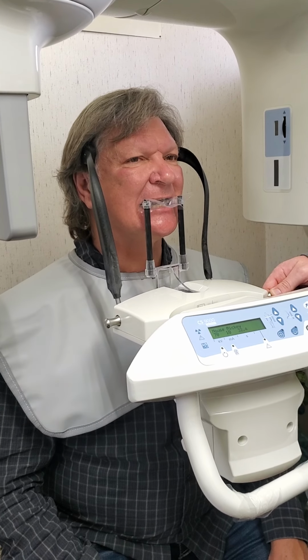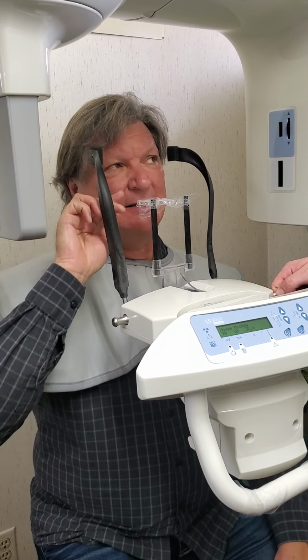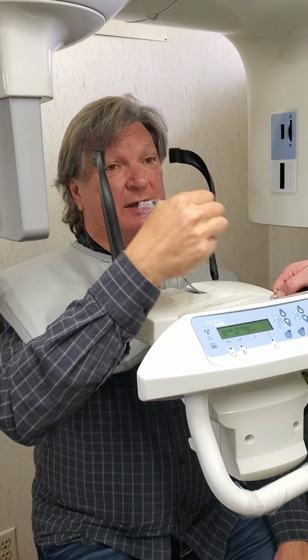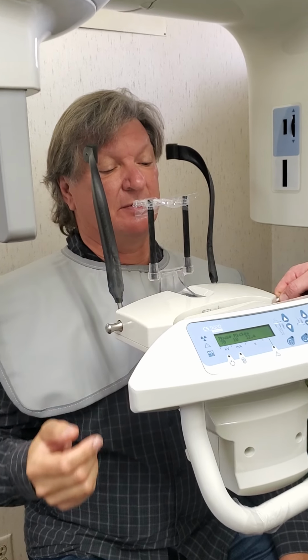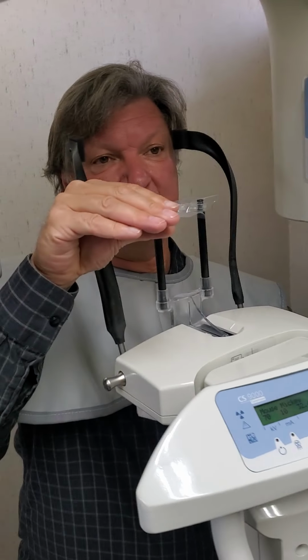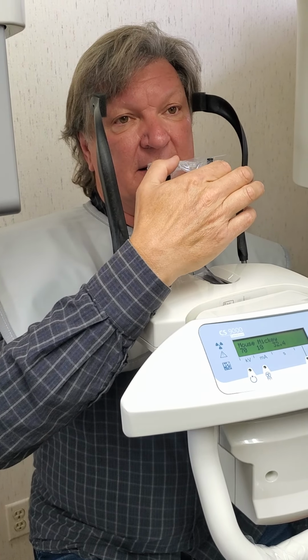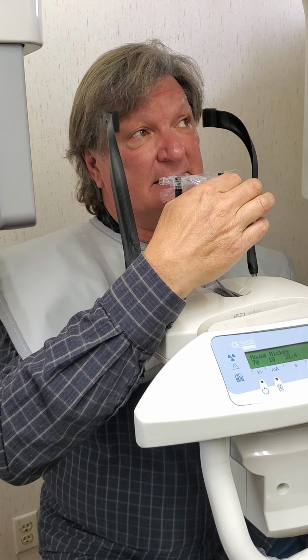Put the whole thing in the mouth? Watch the angle. I mean, I just have to do a little bit of a movement. You guys have to tell me. I don't know where I am this way, anterior, posterior. I don't know, but watch, it's a little bit of angle where I have to move forward so I get as much front tooth touching the tray, which mostly ends up being my canines in my case.